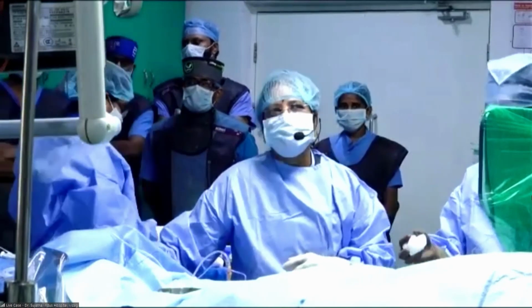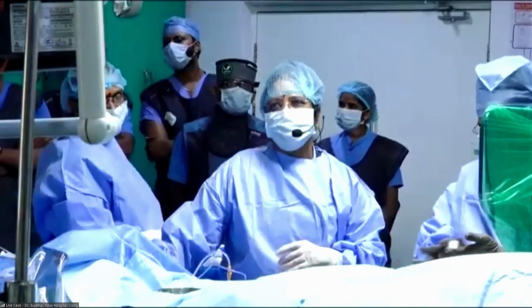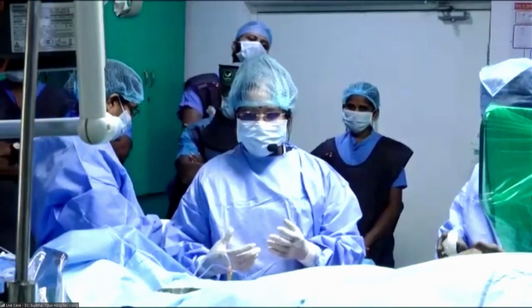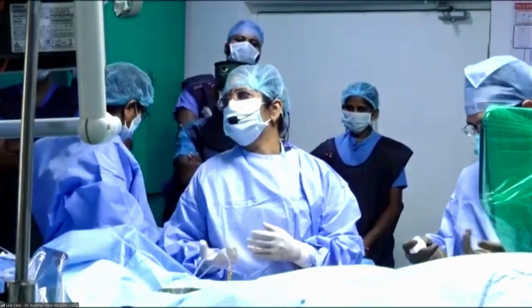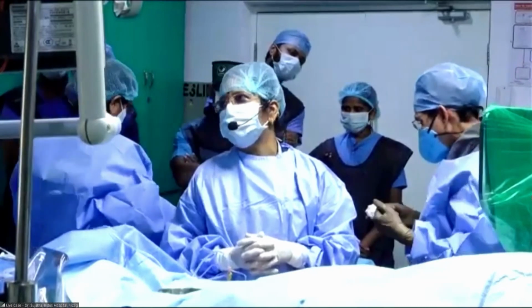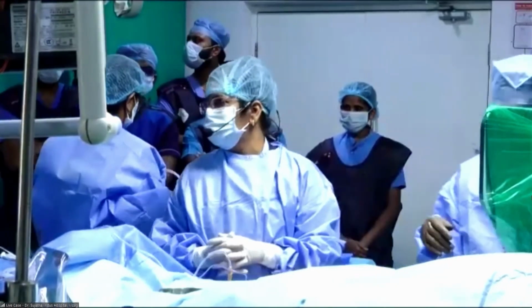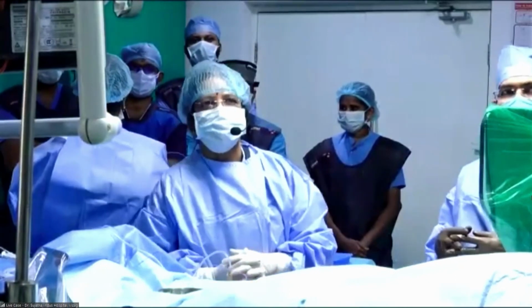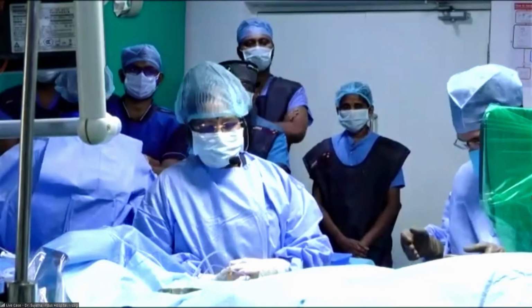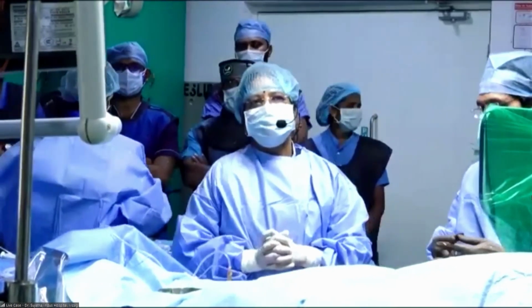Thank you, sir. Thank you very much for the inputs, and thank you for making me prepare the lesion, because most of the times we are so in a hurry to put the stent in. But Dr. Ramesh has pulled me back, made me dilate again. I went up with the 3.5, and now you can see the beauty of the MSA which I got, which is 6.9. Thank you, madam. Great demonstration. Congratulations to you. Everybody is applauding your effort. Thank you again. Thank you, sir. Thank you.